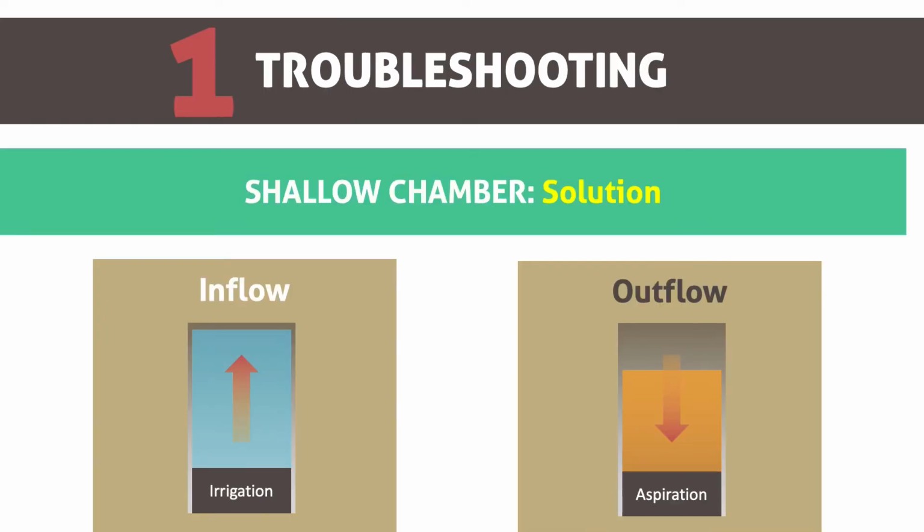In the following slides, I will be discussing 9 problems that can be faced during this step and how to solve it or how can we prevent it. First is the shallow anterior chamber.